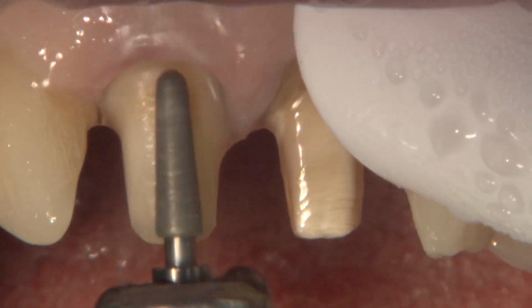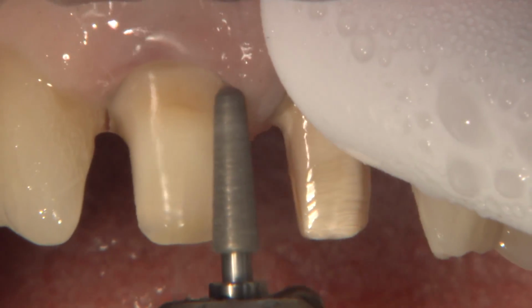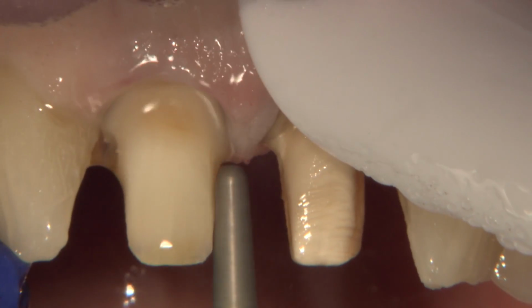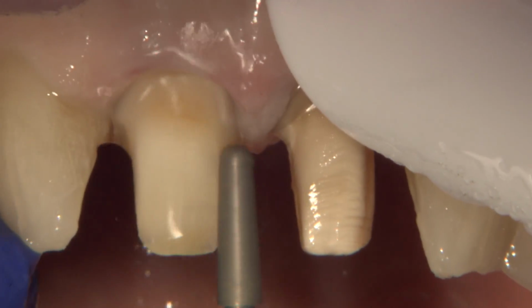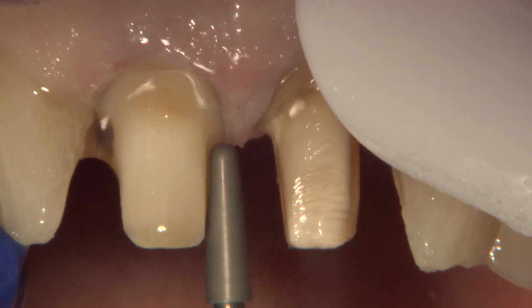And since it's moving the tissues more apically, I can position the margins, especially on 8 and 9, the facial margins, a little bit subgingivally, so that way once the tissue rebounds, it can cover those margins up.